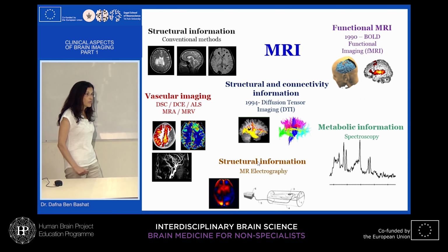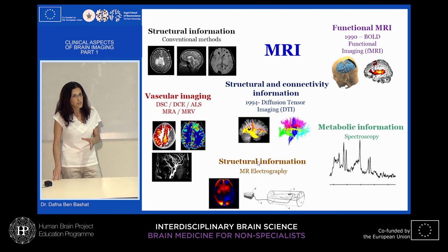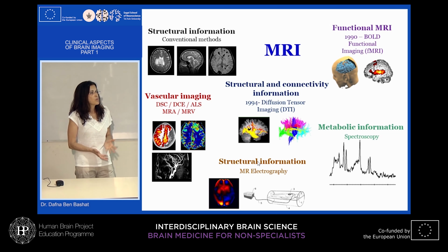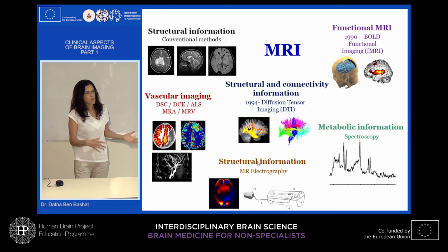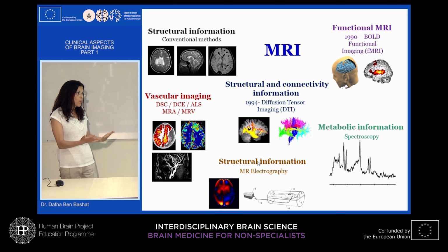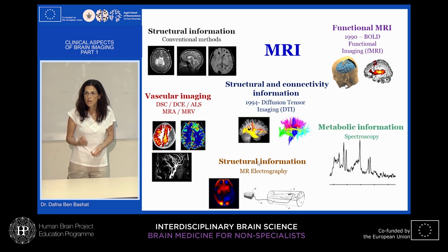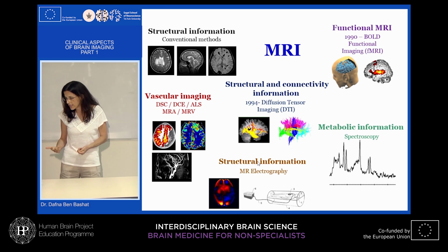And the last and very important advantage, which will be the focus of this talk, is that MRI is multiparametric. When we are talking about CT or ultrasound, we are talking about one contrast. CT is the density of electrons. We transmit an energy, we see the dispersion, we get an image, we can make an X-ray film or compute and get an image. We can play with the window and see it's nice, but it's one contrast, meaning there is one physical property within the tissue that we indirectly detect.